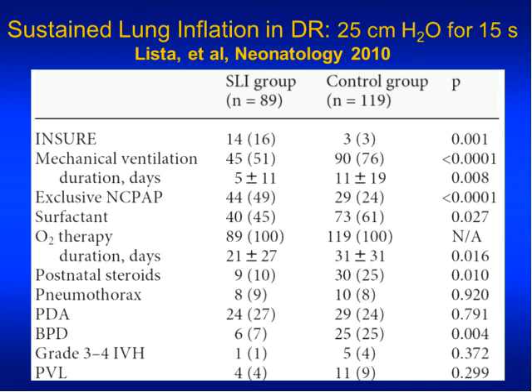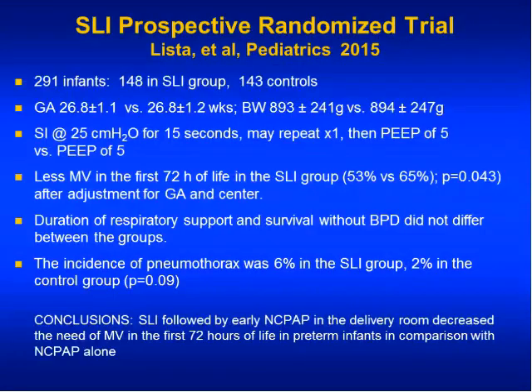There was no difference in pneumothorax, there was no difference in other complications, and there was a substantially lower incidence of chronic lung disease. Well, that would be wonderful news, but this study has obvious limitations, being a historical comparison.